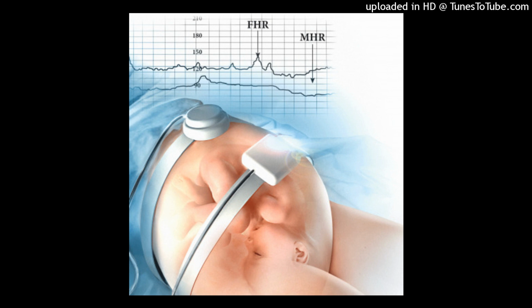In gestations that are less than 32 weeks, the peak of the acceleration must be at least 10 bpm above the baseline, lasting at least 10 seconds from onset to return. Prolonged accelerations have a duration between 2 and 10 minutes. Anything greater than 10 minutes is considered a FHR baseline change.